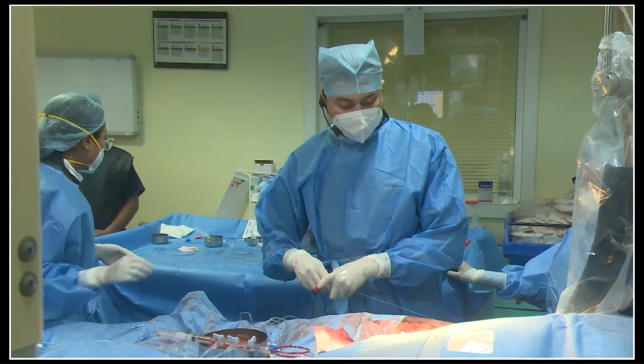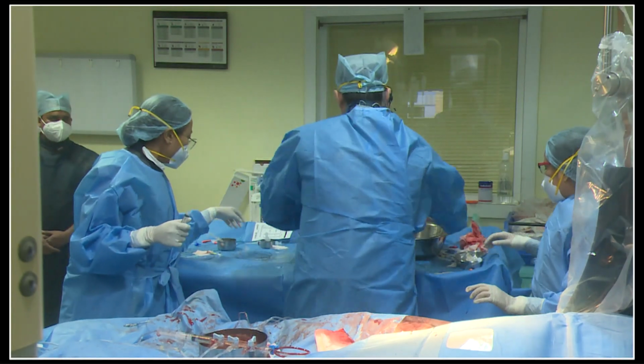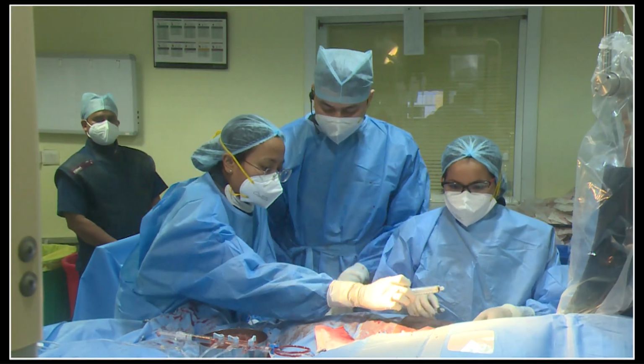So Anand has asked about a proximal stent redilatation. Post dilatation, I believe. Sir, great performance and great to listen to you, and great to have you there. That is more important. No, go ahead, sir.